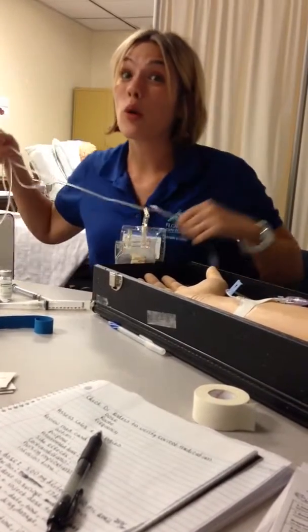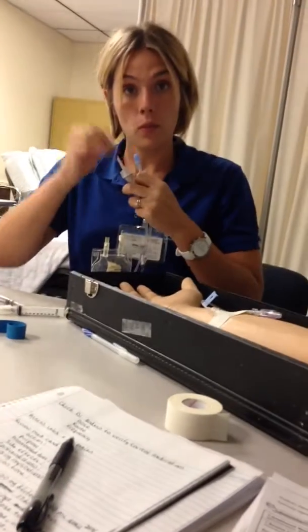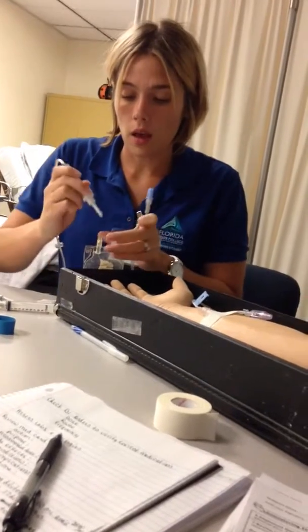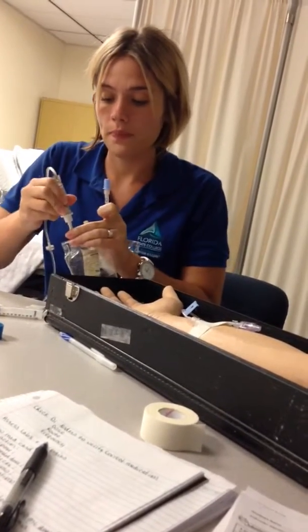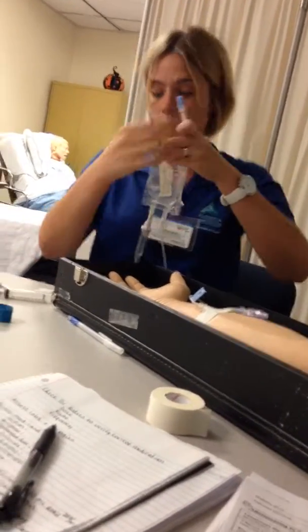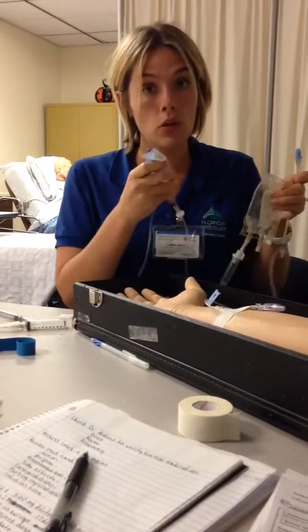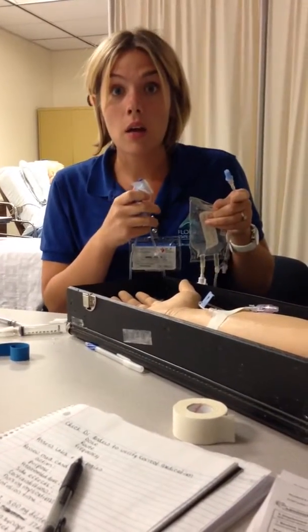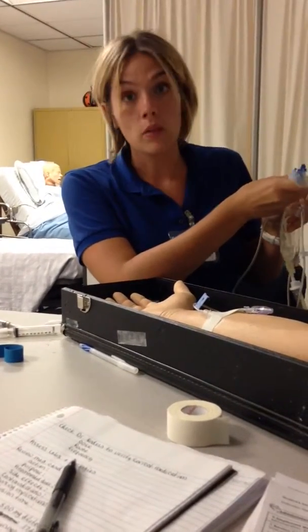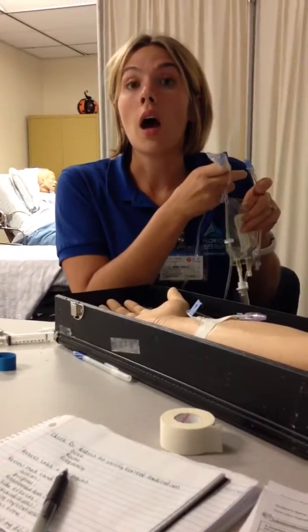Alright, I'm going to need to prime my tubing. I'm going to go ahead, remove my cap, this is sterile, and go ahead and sterilize my mini bag. I'm going to squeeze, inject it, flip it over, and prime my tubing. I'm going to have to unkink with the clamp. I'll know my tubing is primed once I see the solution come over. I don't remove this until I go into the patient's room.